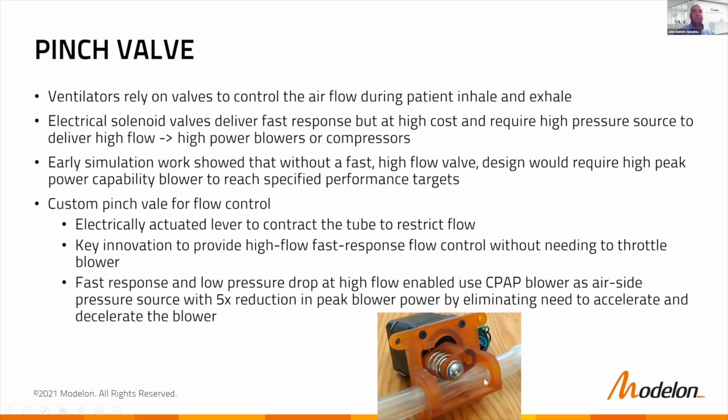So the team actually developed what they call this pinch valve. It's an electrically actuated lever that basically contracts the tube to restrict the flow. And this was a key innovation to be able to provide high flow and fast response without needing to throttle the blower. We'll show you some systems with and without it, and you can see the difference that it makes.